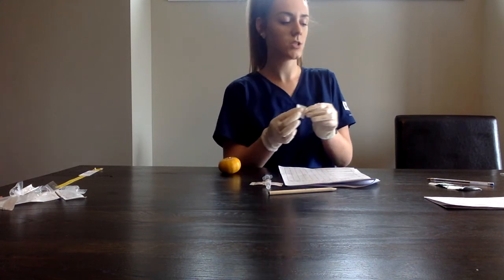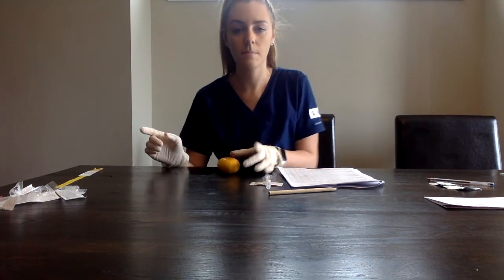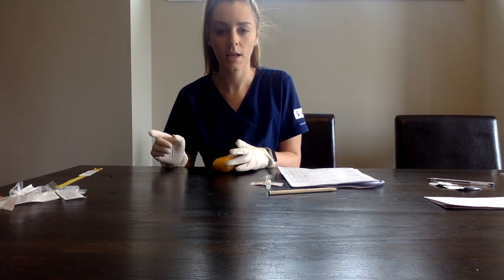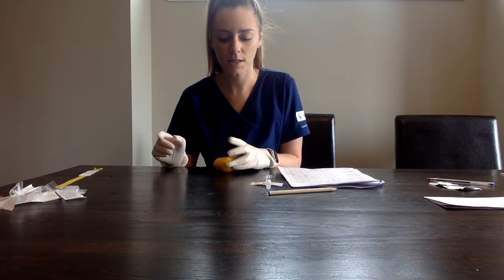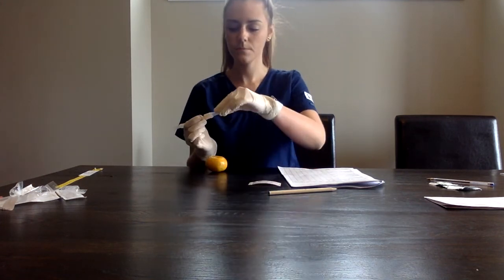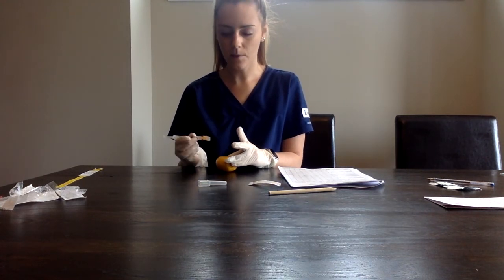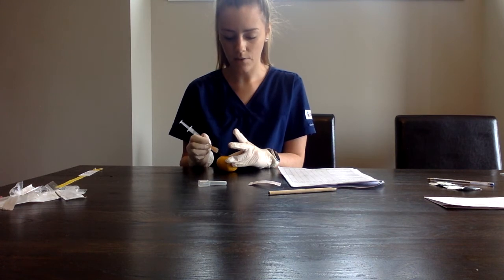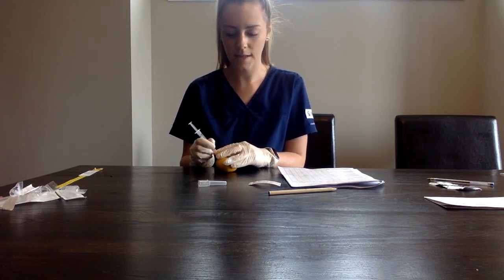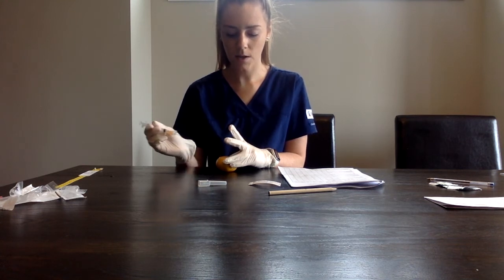Okay, and then we can just throw that into the garbage. Now when we give this medication, we're going to be bunching up the skin. I'm going to stabilize with these 2 fingers, and then we'll inject at a 45-degree angle. So I'm bunching up the skin right now. I'm injecting at a 45-degree angle. I'm stabilizing it while I bunch. I'm injecting the medication, removing the needle, and then I can release the bunch.